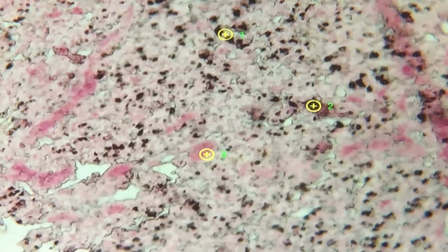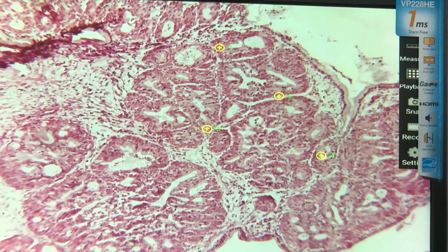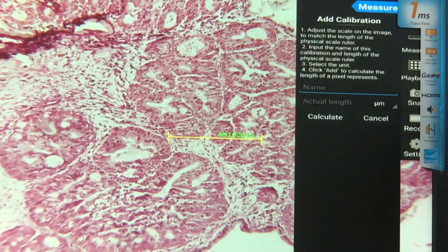I'm sure you will be glad when you see this in the practical exam, and you will do well because it will come out. It is very important. We have plenty of this type of pathologic process. Lymph node.